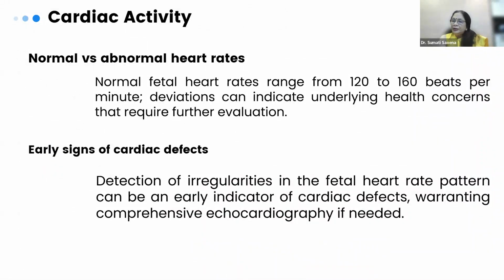So it is a very important feature. And when a fetal pole appears in the gestational sac, we also look for cardiac activity in the fetal pole. If cardiac activity is absent, then it is a missed abortion and a form of pregnancy failure. But if cardiac activity is present, then we note its heart rate and rhythm. The normal heart rate is 120 to 160. But at around 7 weeks, if the heart rate is less than 100, then it is known as fetal bradycardia, and it is also suggestive of poor pregnancy outcome.